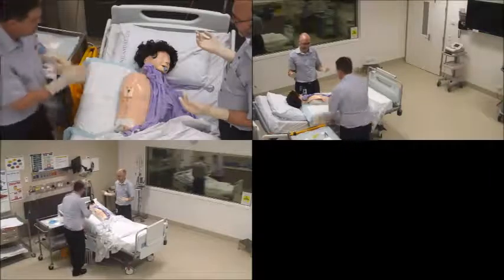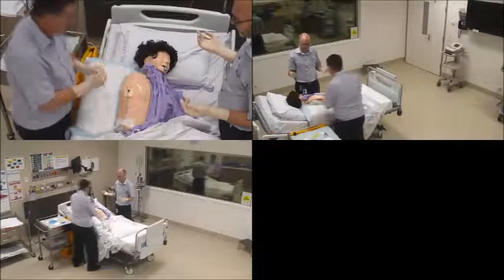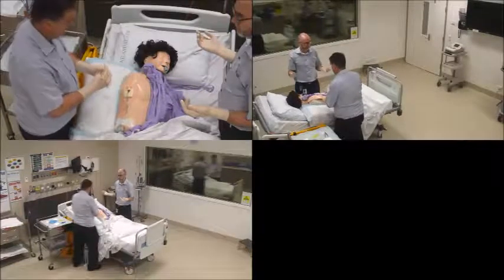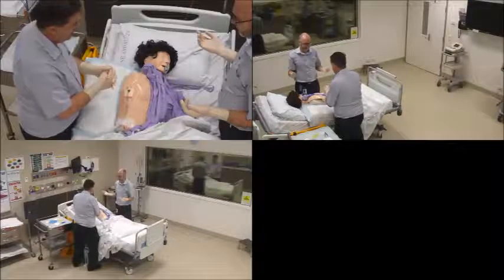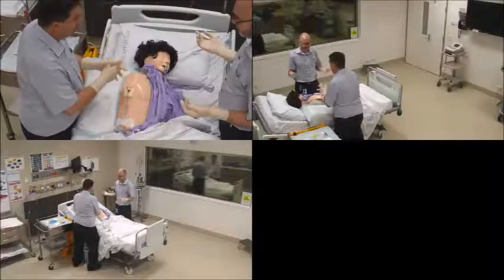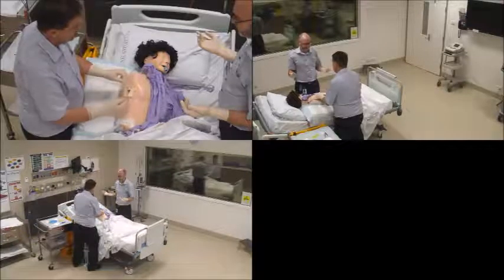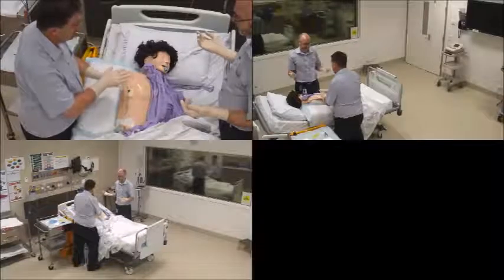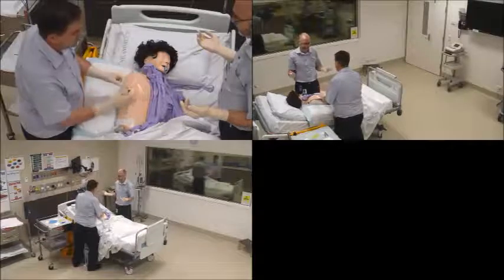Alrighty, Scott. We're going to practice that breathing technique that I was talking about before. Okay? Yeah. So first thing I want you to do, can you breathe in for me? And breathe out. Then breathe in, breathe out. Take a really deep breath in, and then hold it. Now while you're holding your breath, I'm going to cut the suture, take the tube out. Kim's going to put the Steri-Strips and the dressing on over the top, and once that's completed, I'll then say breathe normally, and you can breathe normally.